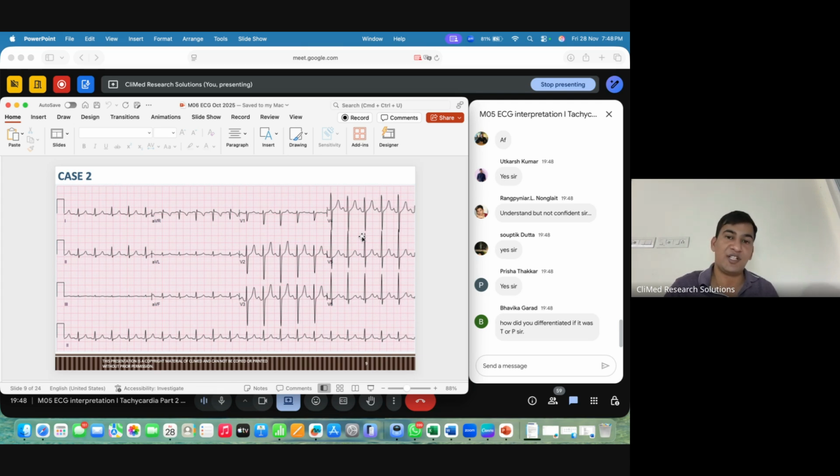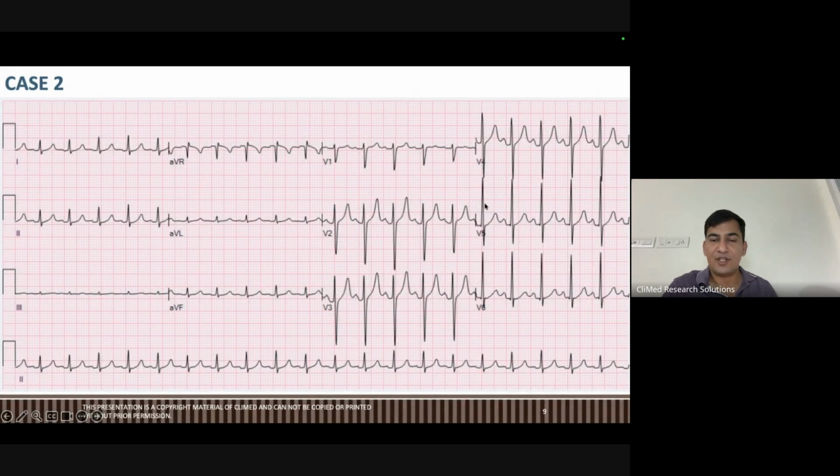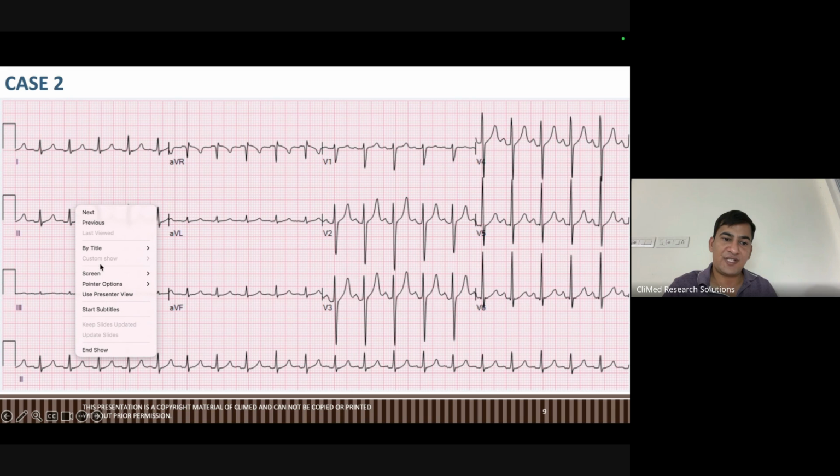Very nice question, T wave or P wave. I mean, really very nice question. See, I'll show you that. I'll explain this. Okay, any other questions here? Any other questions, guys? See, look at me and look at the slides clearly.